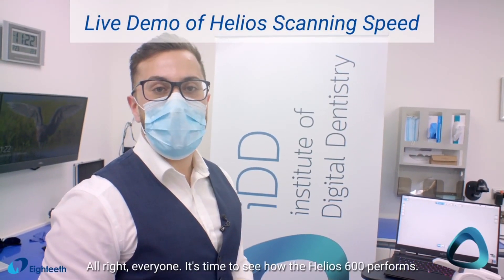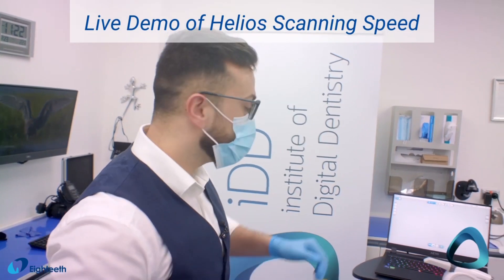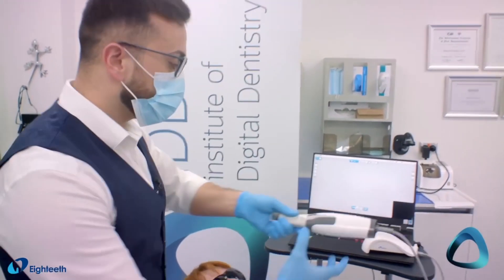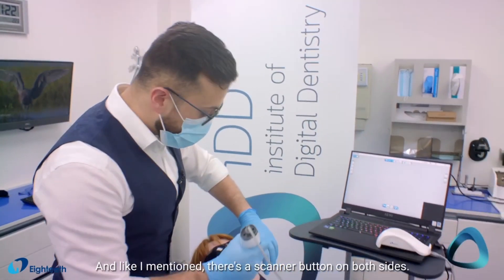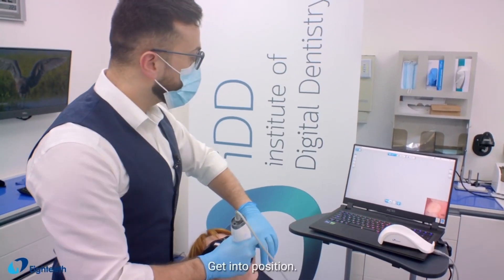Alright everyone, it's time to see how the Helios 600 performs. Let's carry out a full arch scan. There's a scanner button on both sides — get it into position.